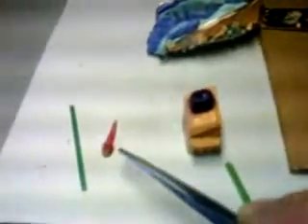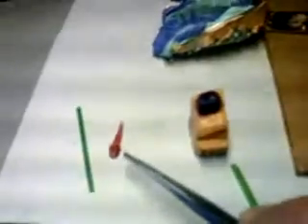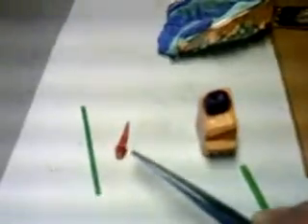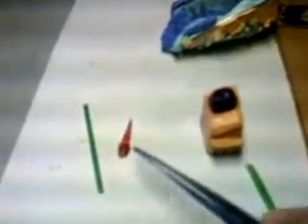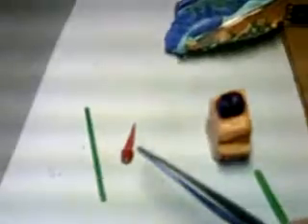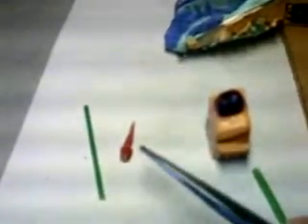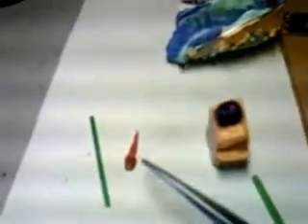While instead, in achieving this post core in Duralay with only one material involved, we do have only 1, if we suppose a numeric margin of error, and that compares against a margin of error of 3 done by the wax-up on the die.